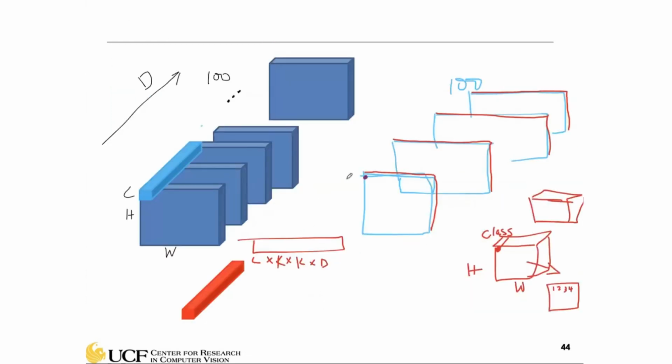Here, just to give you a better idea, I drew this not very good sketch, but hopefully you are still able to get a sense of what this 3D convolution looks like. Again, you can imagine, if medical image volumetric slices are difficult to understand, consider video processing. So this is the video frame.